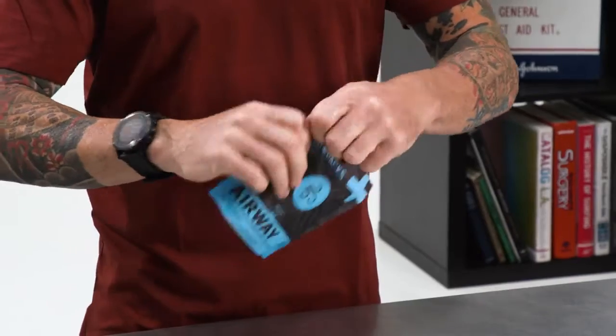Hey, what's up everyone? Today we're exploring the anatomy of the Airway MedPak. With all our MedPaks, they can be standalone kits, they can augment your current kit, or they can replace some of the stuff that you've used out of your kit. If you use this as a standalone kit, it comes in a cool little resealable waterproof bag. Let's go ahead and get into it.